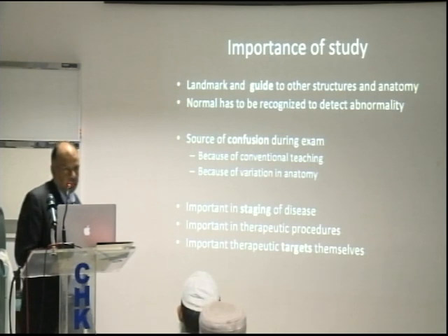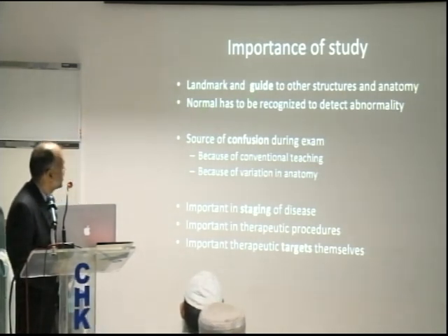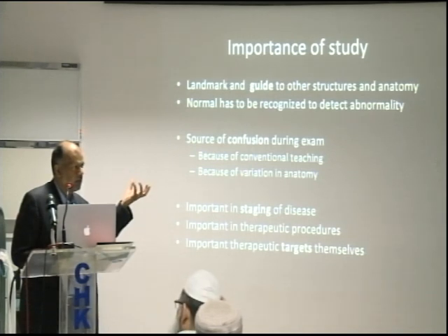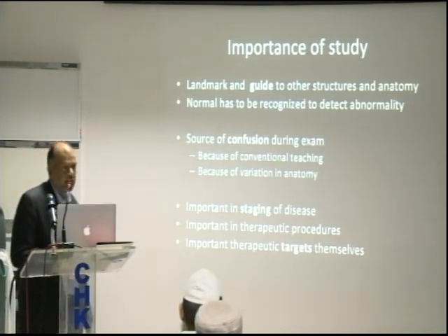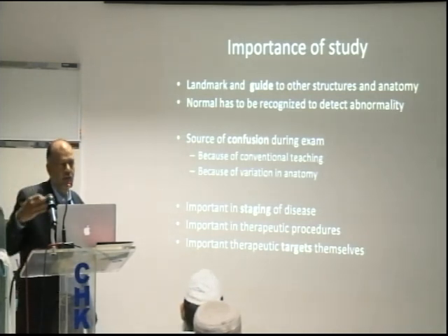Why the vessels? Vessels are very important. They serve as a guide to other structures, and they can be a source of confusion during exams. If there are a lot of vessels coming up and you don't know what they are, they can cause confusion, and this is because of conventional teaching. As I emphasized just now, we're telling you only the main vessels and not the other vessels.